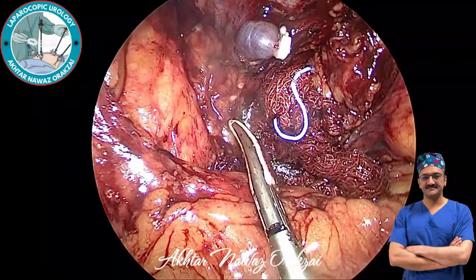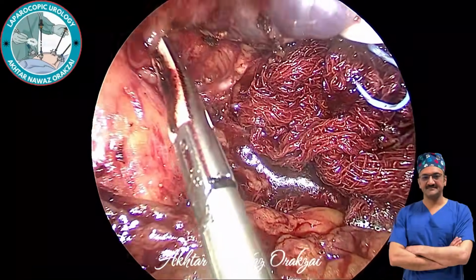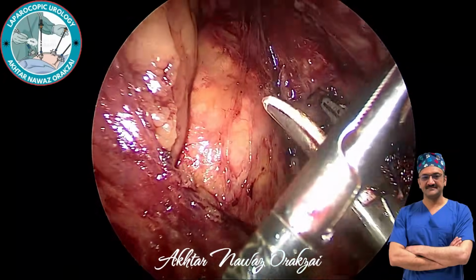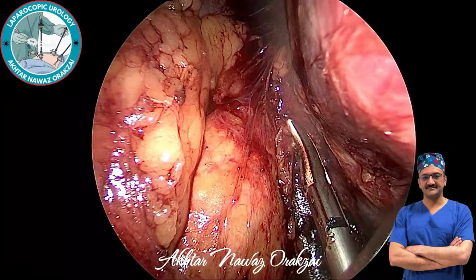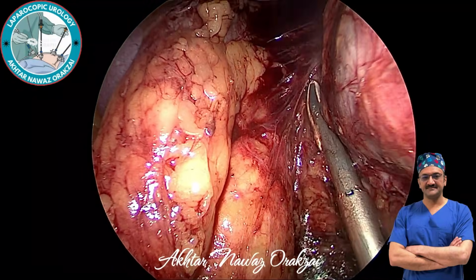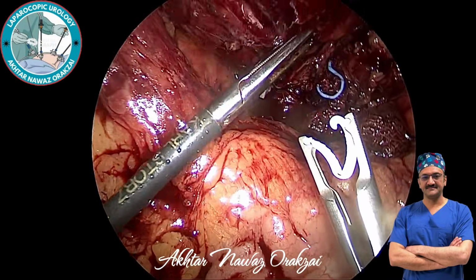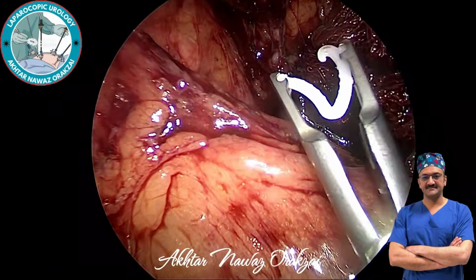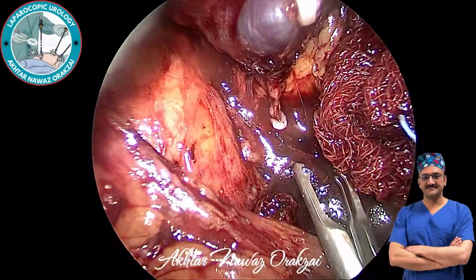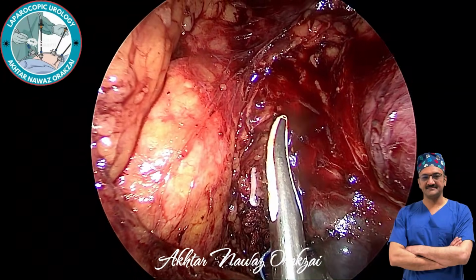Here you can see this is the artery. The lumen seems to be a little big, although ligashore can cover it very easily and can seal it. However, we prefer to apply one small Hem-o-lok clip as well. So we are applying that clip. The artery is controlled, and then we are using the ligashore to further dissect.